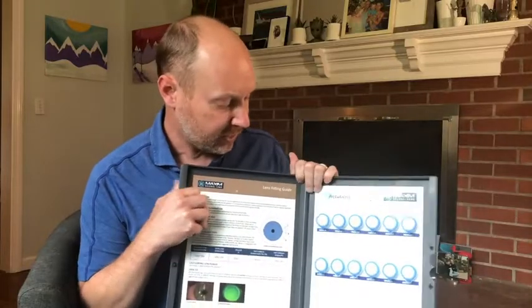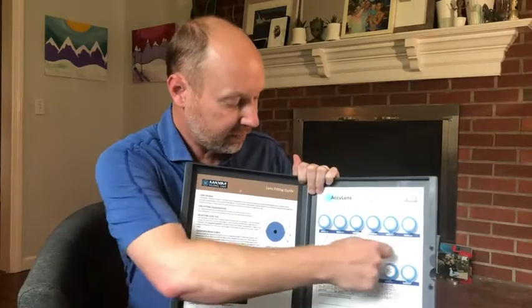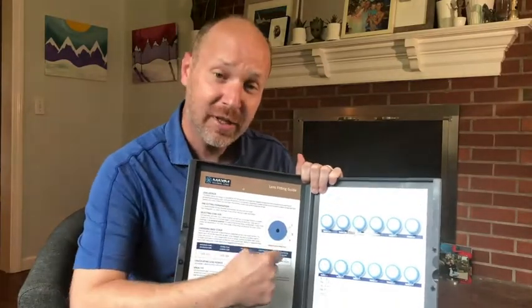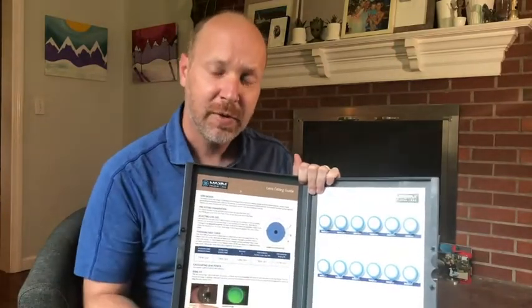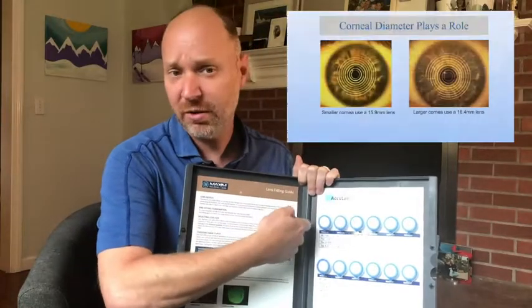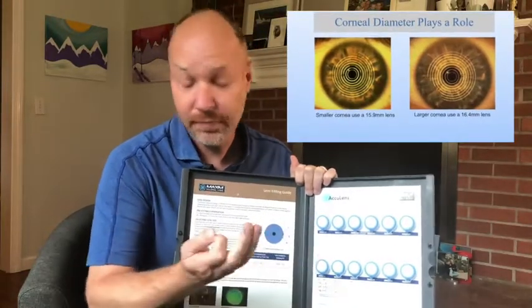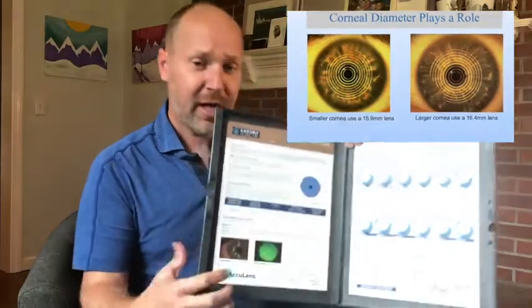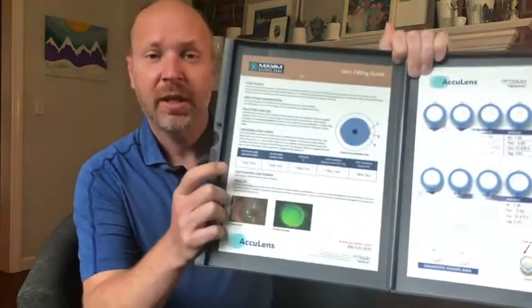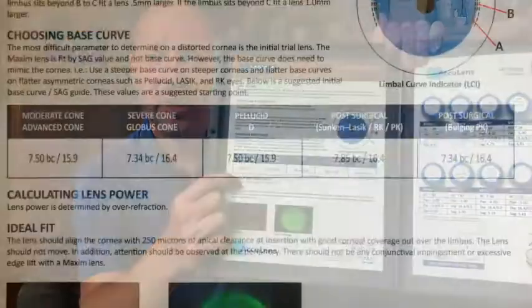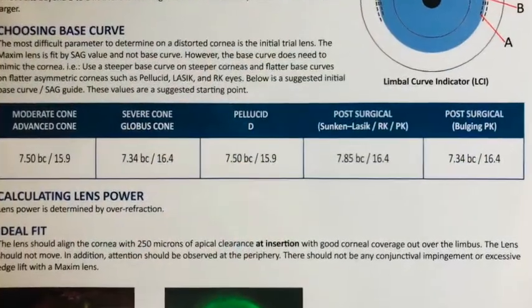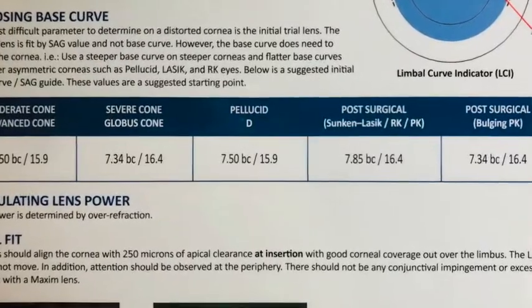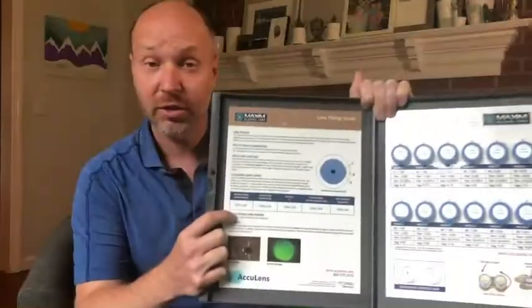So if you already have this fit set, you kind of know what you're looking at. The top row here are 15.9 diameter lenses, the bottom row 16.4. Let's keep it simple: smaller corneas fit a smaller lens, larger corneas fit a larger lens. There is a fit guide here when you're initially fitting a lens — if you just need the right choice of lens based on the corneal condition, you can start there.